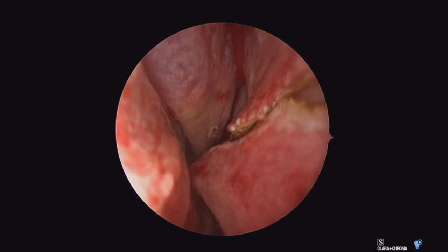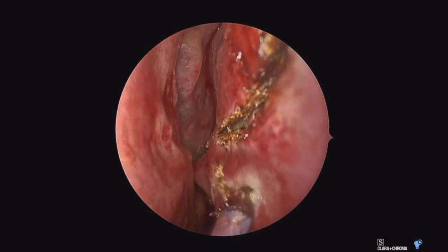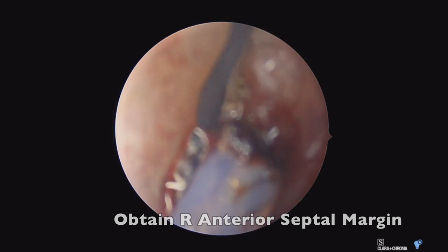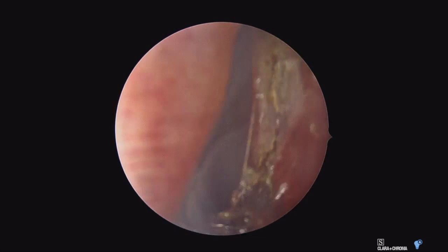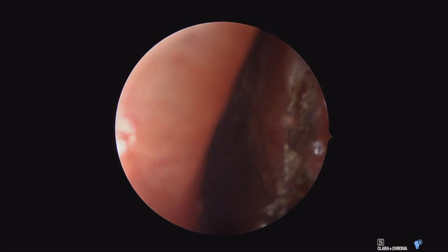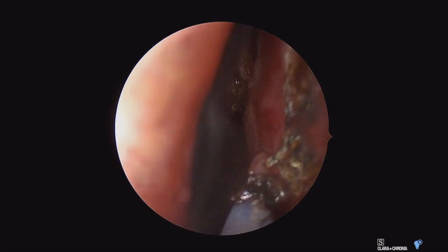A large nasal septal flap is not possible in a case like this due to tumor involvement. So even if we had chosen a purely endoscopic craniofacial resection, a pericranial flap would likely be needed for reconstruction. In this combined open and endoscopic approach, the pericranial flap is already raised and accessed, and we'll drop that in from above for our reconstruction later on.